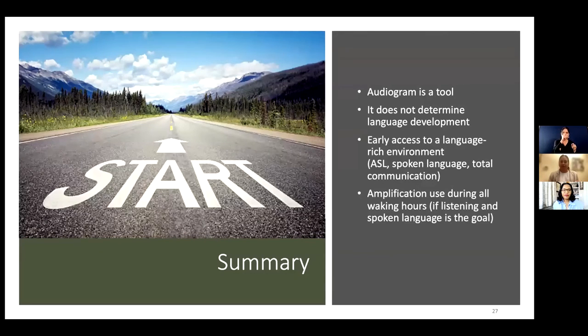And then we can compare the two to determine if the hearing aid is not functioning properly, in which case it needs to be repaired, or if the hearing aid is functioning properly, but your child is still not understanding speech as clearly or as well as we would expect them to, then we would look at their hearing levels and get an updated hearing test to determine if there has been a change.